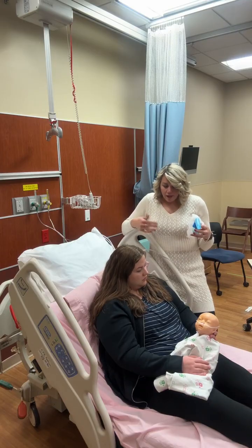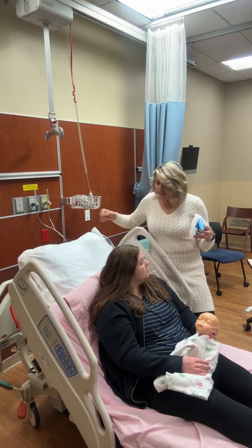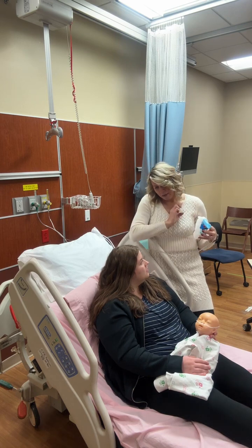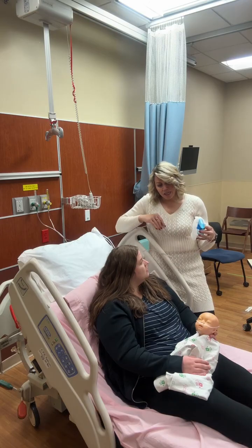So if you want, I can hold it, or if you feel comfortable, you can hold it in front of the baby. What's going to happen is I'm going to turn this on, and the medicine is going to nebulize through, and a mist is going to come out. And so I need you to hold this upright, and I'll show you what happens if you tilt it. And then we're just going to hold it in front of baby.